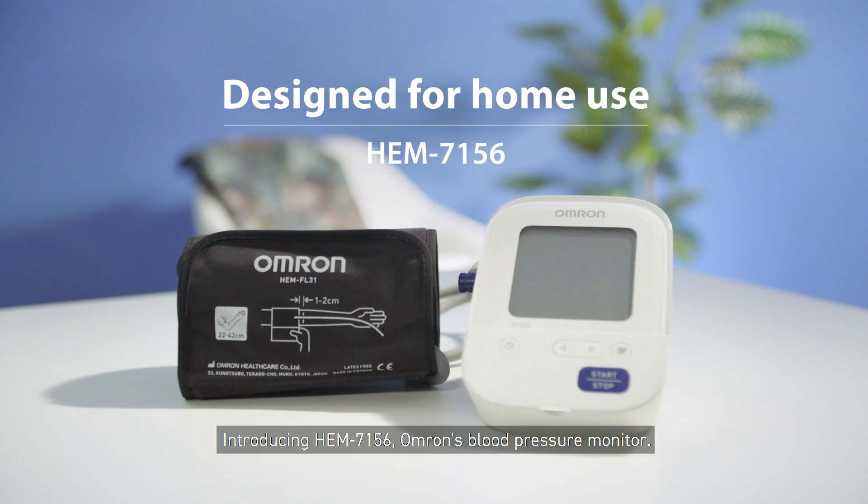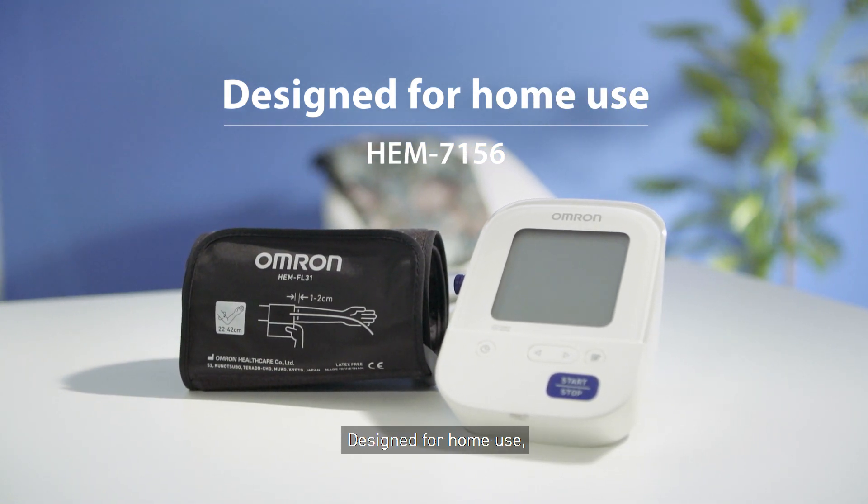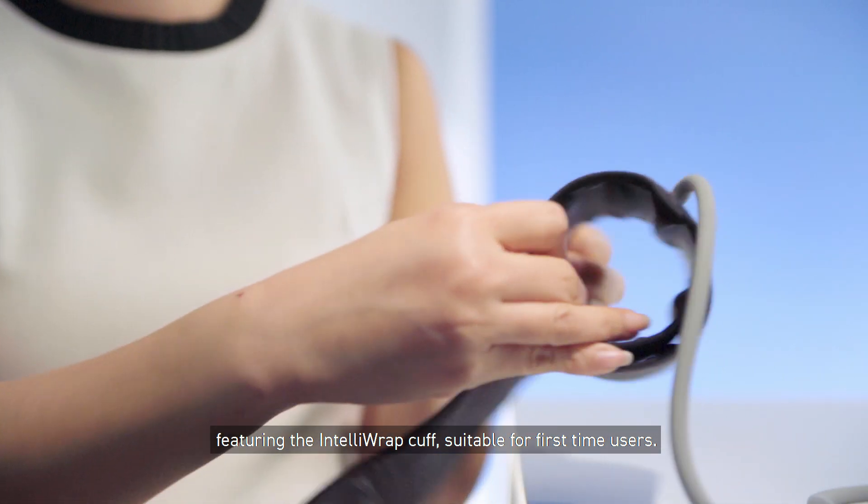Introducing HEM 7156, Omron's blood pressure monitor designed for home use, featuring the IntelliWrap cuff suitable for first-time users.